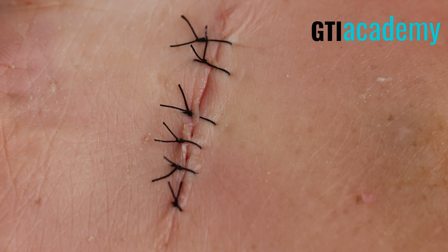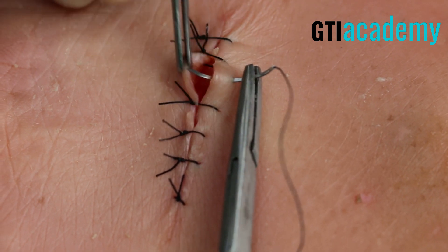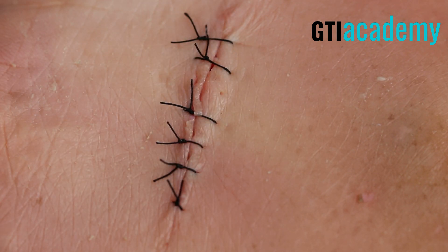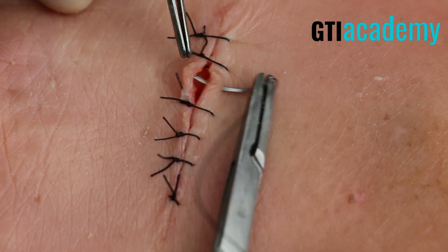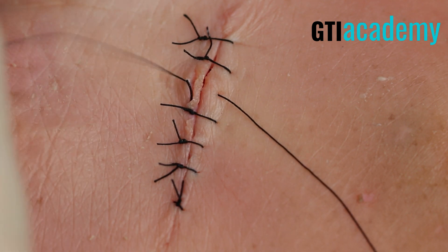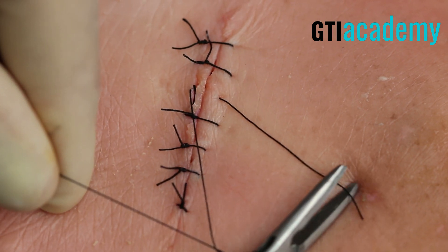Looks like there's one more space right there we can address. We'll take this one right here — I've just pulled that one through. This will happen in real life as well, so don't give up, don't take them out. You can simply re-enter that same area, which is what I'm going to do right now. There you go — drive through. And this wound is going to close really, really well.